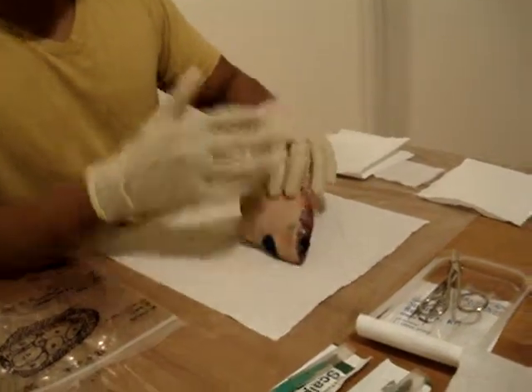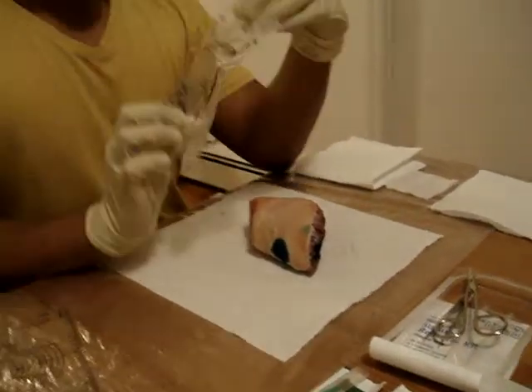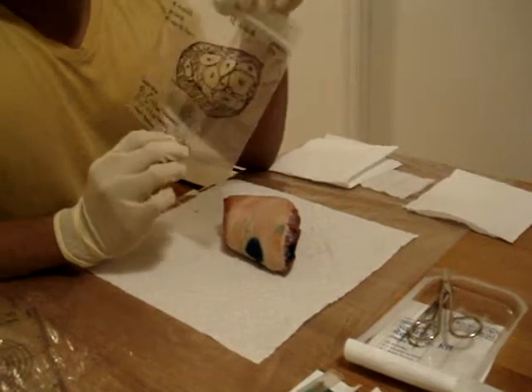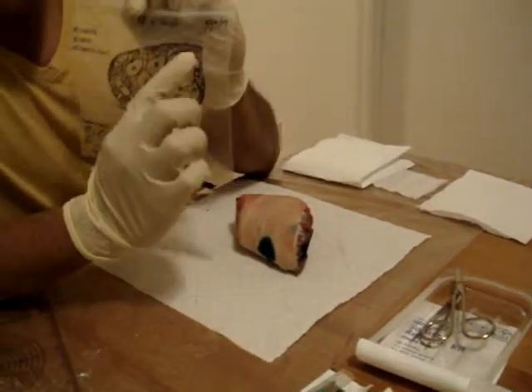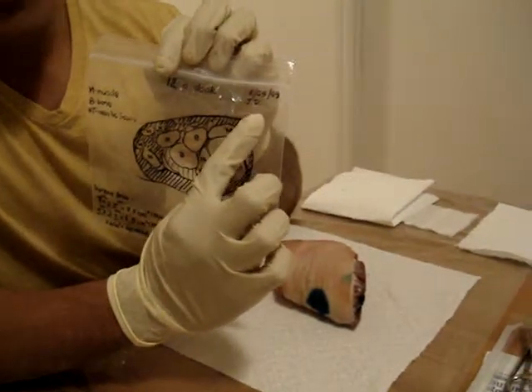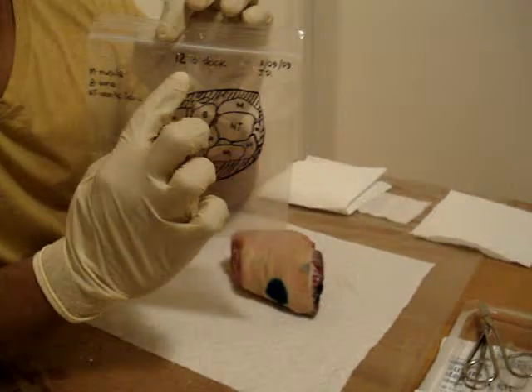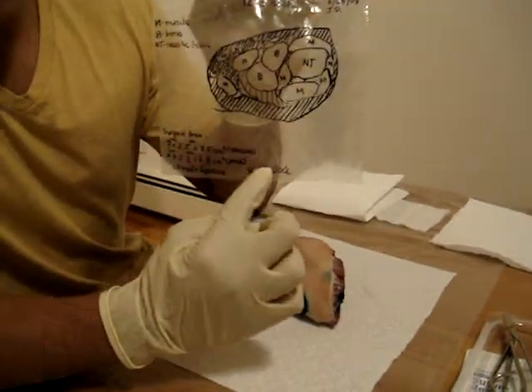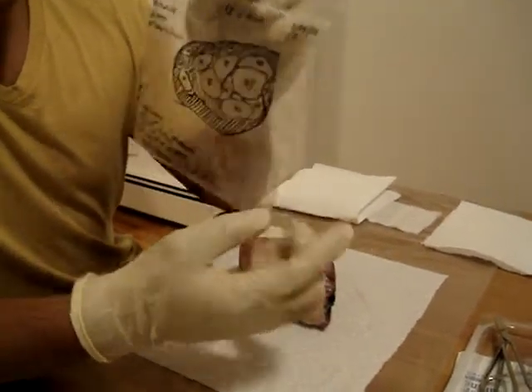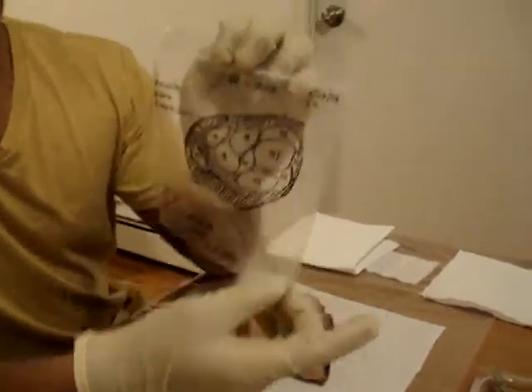Alright, so we are going to start with wound tracing, and I have prepared the wound tracing baggie here. I have put on the date and the initials of the patient here on the top right corner, and then I also put the orientation, the 12 o'clock here on the top, the 6 o'clock here on the bottom, and then I now traced the main ham hock. And I labeled the parts.